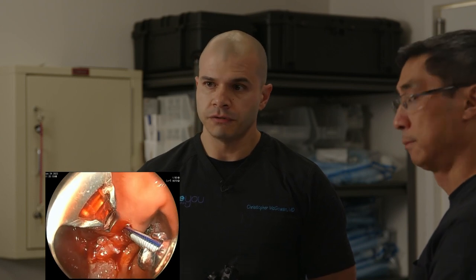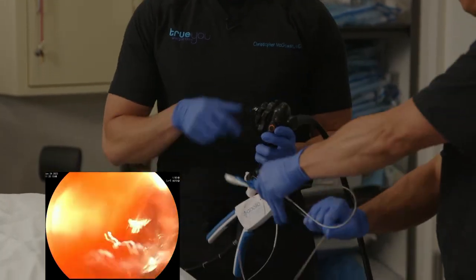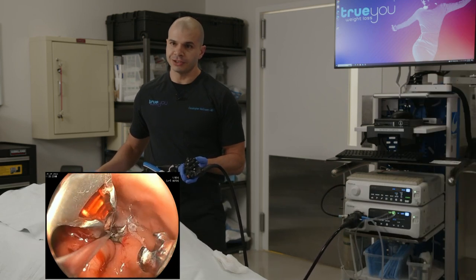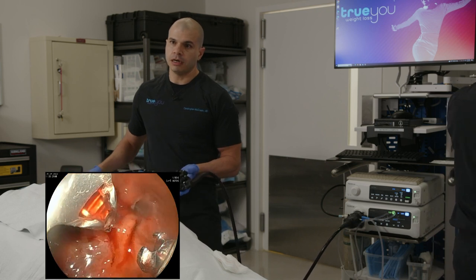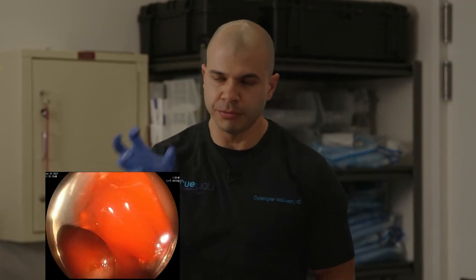Now, I'm cinching this reinforcing suture. Go ahead and cinch there. So that's going to add a little bit of strength just proximal to the outlet revision. And so there's our opening. Now, we know that is still 8 millimeters. It's very snug, but that is an exact 8 millimeter revision. And now I'm going to work on the pouch a little bit. You can see where we ablated the mucosa. I'm going to suture over that to perform a gastroplasty, much like we would do with an ESG, but on a much smaller field.